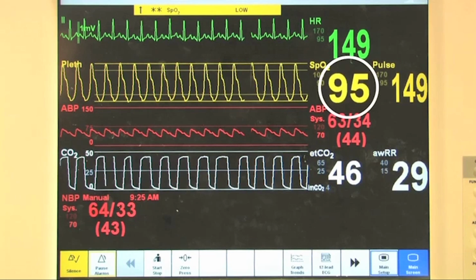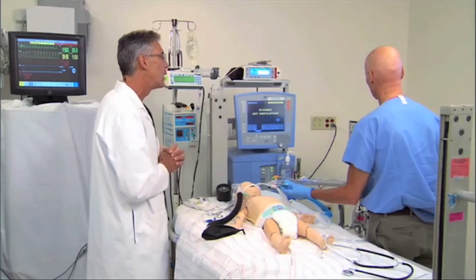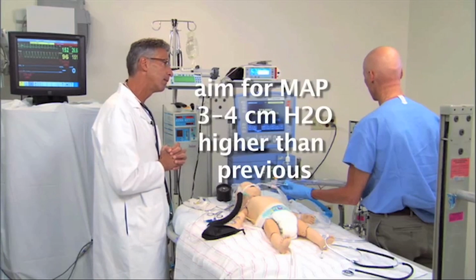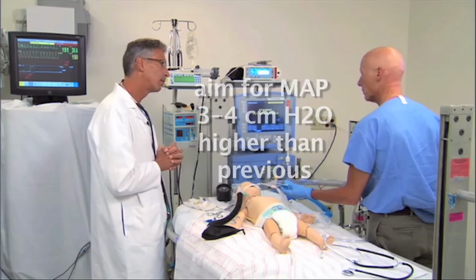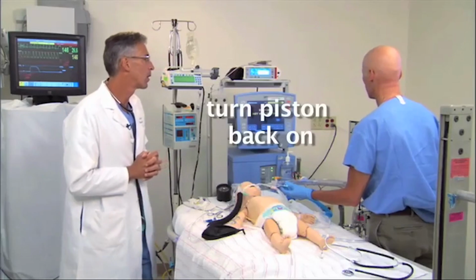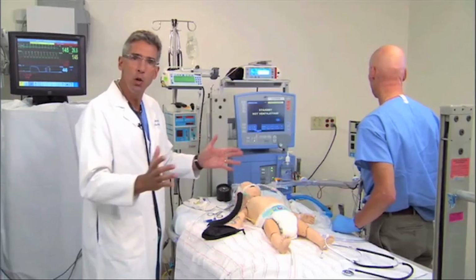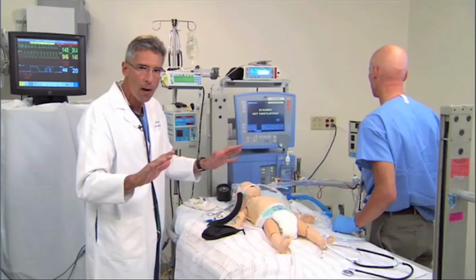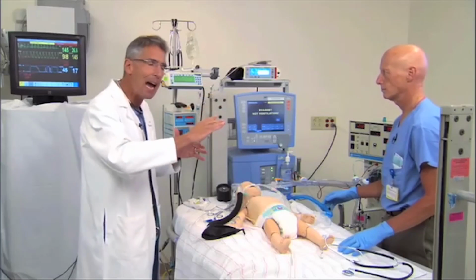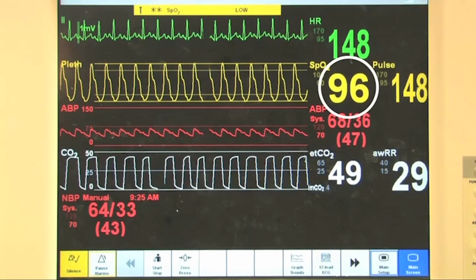It's now 95. Barry, let's come back down. We were at 24 before. Let's aim for a mean of 27. I'm slowly coming back to 27, John. And let's turn the piston back on before we forget to do that. So that was a recruitment maneuver using the device, no disconnection required. We opened up the lung with 35 centimeters of water, and now we've settled back down to a mean airway pressure of 27 centimeters. And our saturation is 96%.